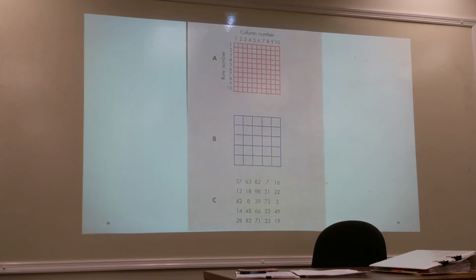So what would change is if the manufacturer determines that you have more pixels or less pixels. So this is the pixel. How would you describe this versus this? The pixel size. Better detail? Smaller? Yeah, this one's better detail. The smaller the pixel, the better detail you have. But we call this an increase in pixels. This is called an increase in pixels because we have more.